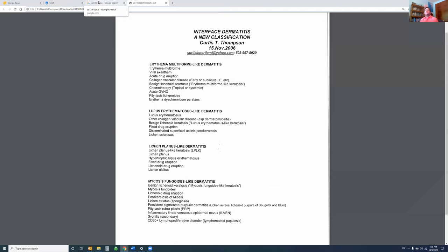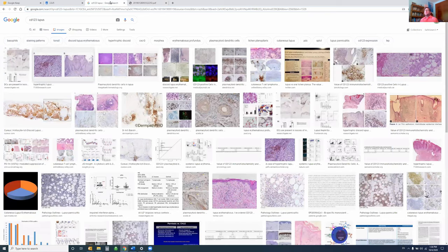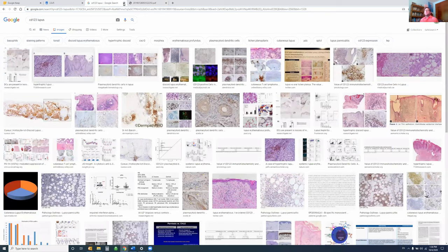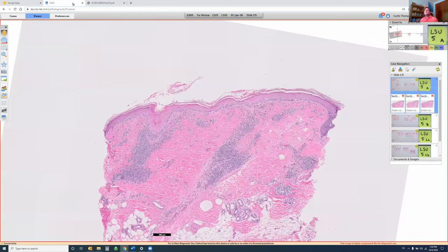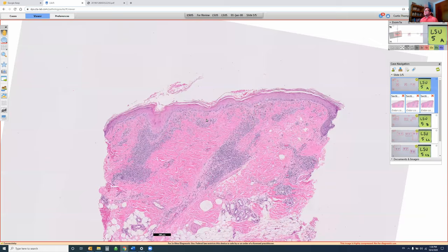Case number one is lupus erythematosus discoid, linear variant.